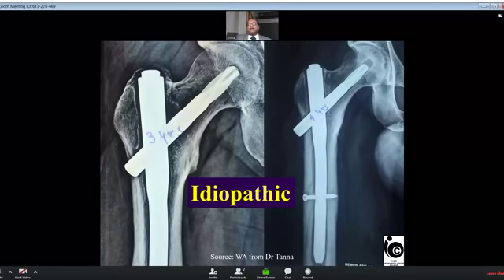Even after the fracture heals, I have seen some of the implants breaking, and this is an example of an implant walking to a Z effect. See, as I said earlier, this is a single screw. That's why I call it walking out rather than calling it a Z effect.